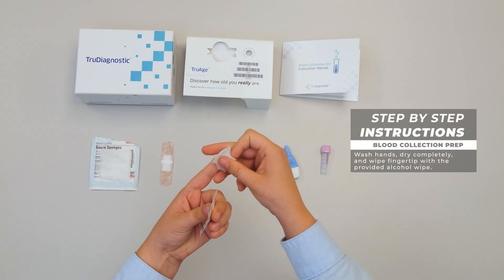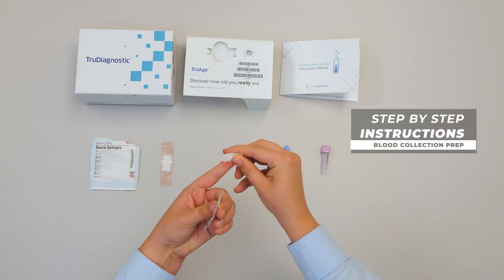Wash your hands, dry completely, and wipe your fingertip with the alcohol wipe.